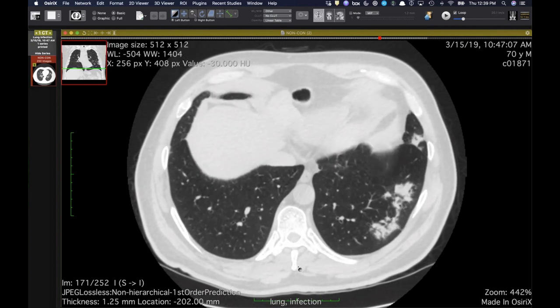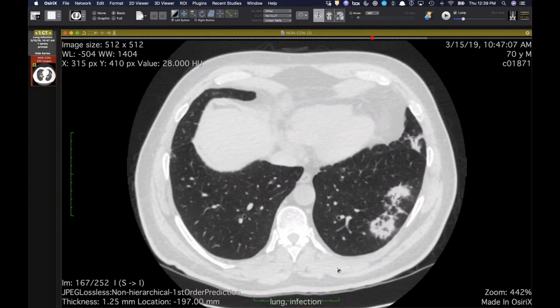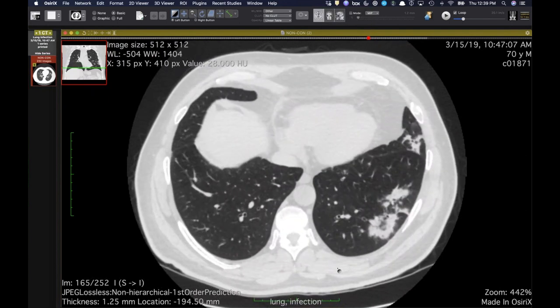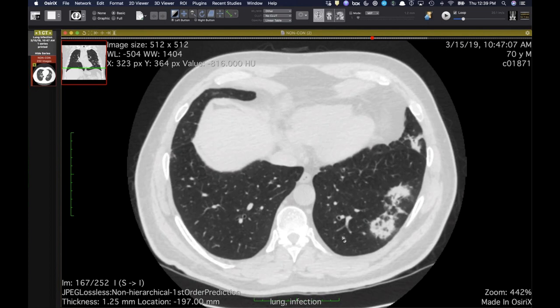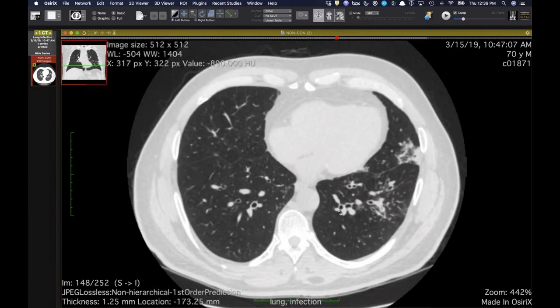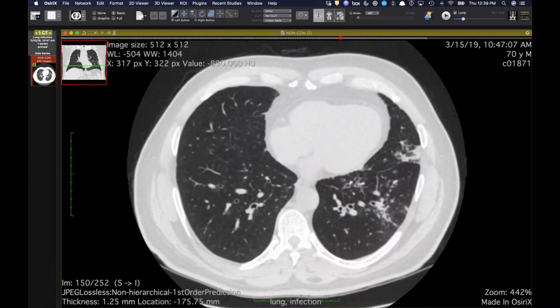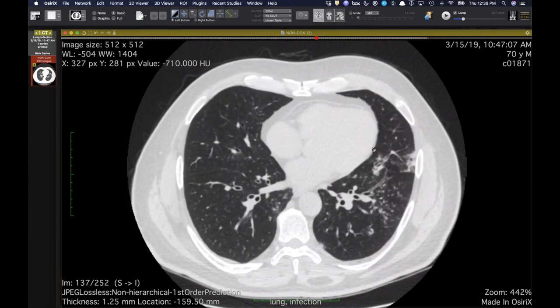And interesting. When I've seen it a few times, you see it usually with granulomatous infection, but other infections too. And compare this to the reversed halos you see with COVID. They're cleaner looking. Oh, sure. Or with organizing pneumonia of other cause, drug reaction, or whatever. And much more symmetric too. Yeah, and probably what it is is just organizing pneumonia around the airways that already have centrilobular nodules.